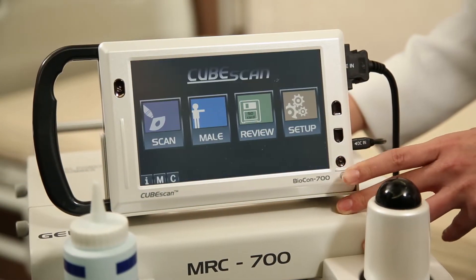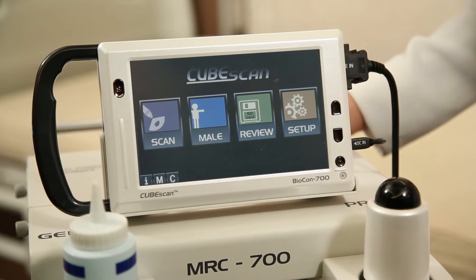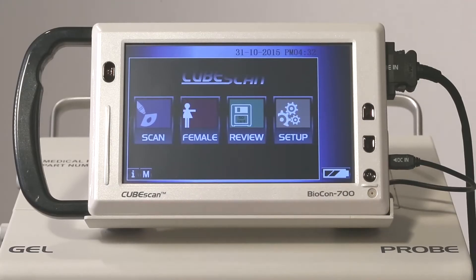Press the power button to turn on the device. Select patient type.